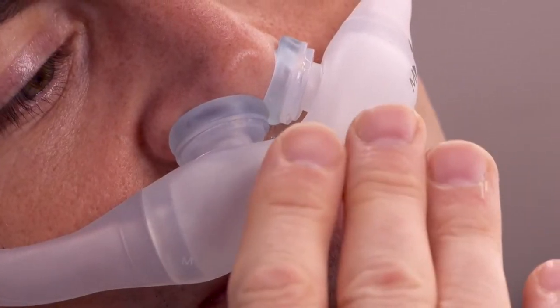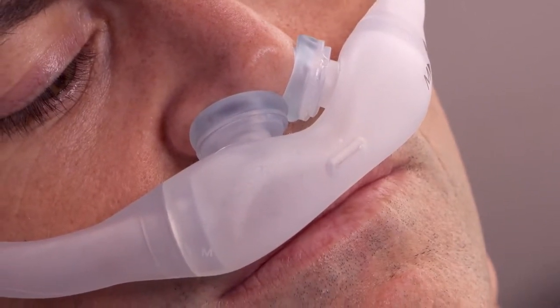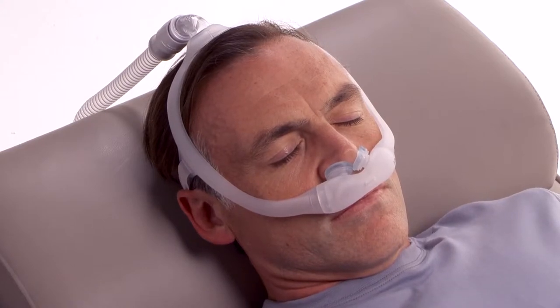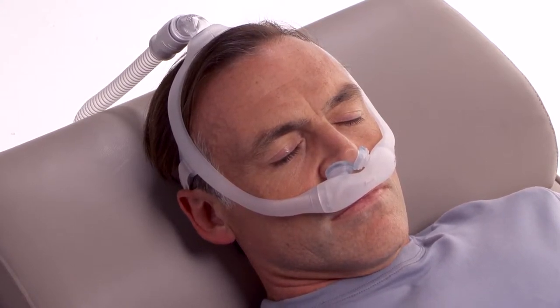You should feel air escaping from the exhalation port, which must be left open to prevent re-breathing. Never over-tighten the headgear. If too much air is escaping, try another cushion or frame size.